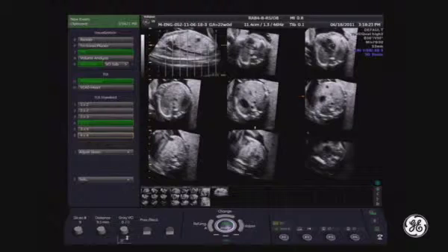Here we can observe that at this point we can see the urinary bladder. At a level slightly higher, you can see that two vessels are arising from the abdomen towards the umbilical cord. So these are the umbilical arteries. You go a bit higher to the upper abdomen.